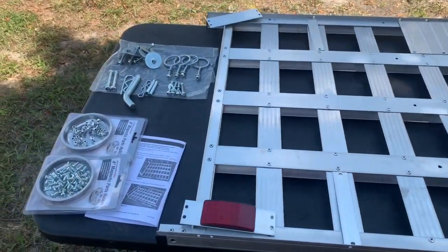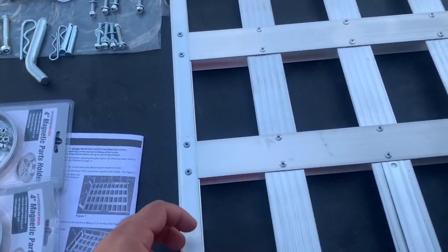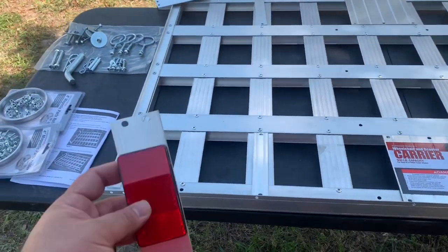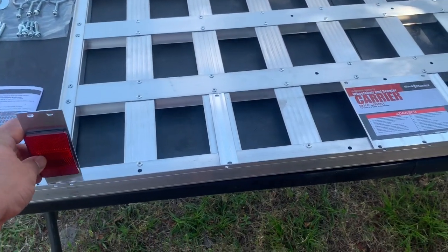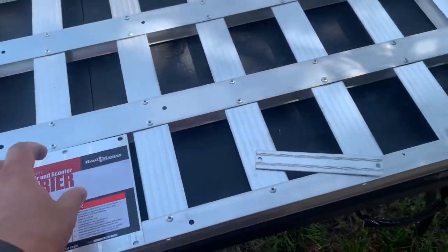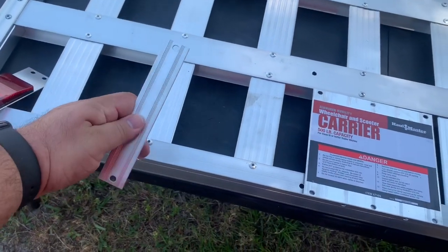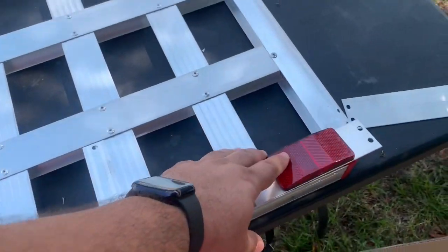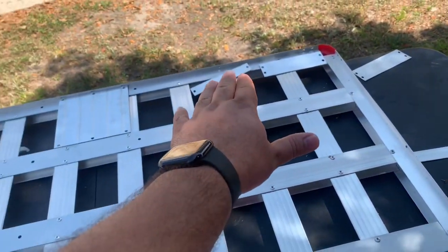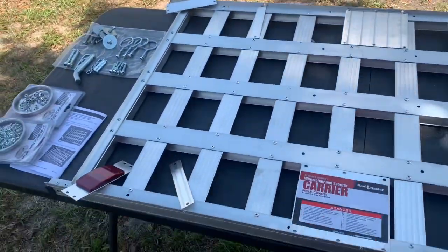I've separated all the pieces. I have all the screws, all the nuts, and all the remaining pieces. Here's how you're going to set this thing up. It comes with two reflectors — you want both reflectors on one side. You're going to put one reflector here, a small plate here, another small one here. It has one screw hole. Then another reflector here. You have big pieces, small pieces — I'm going to put it together.